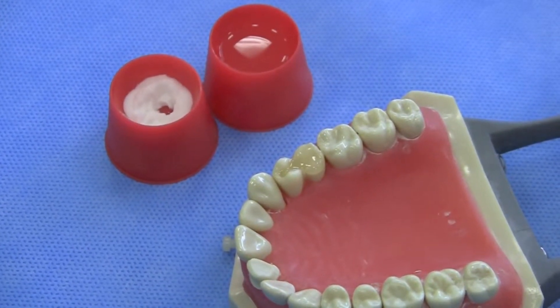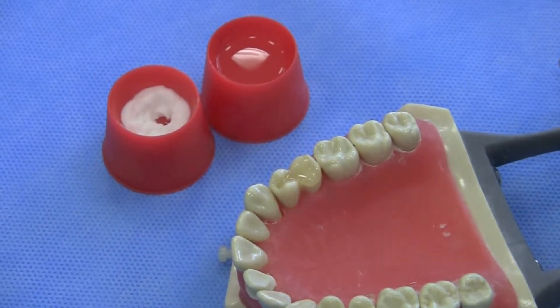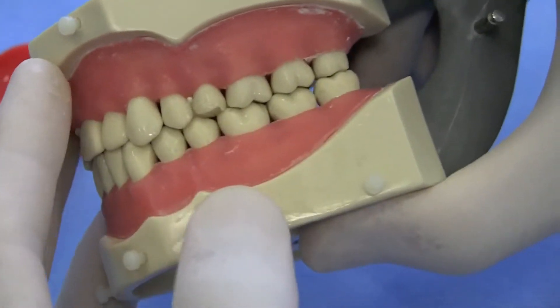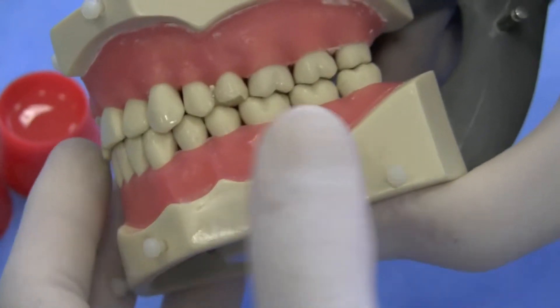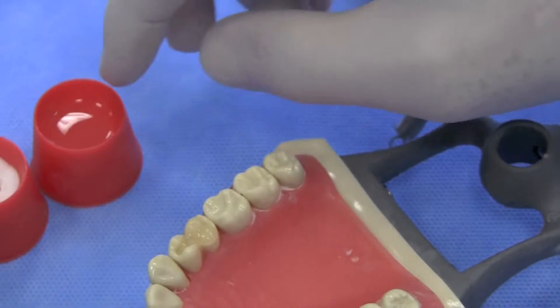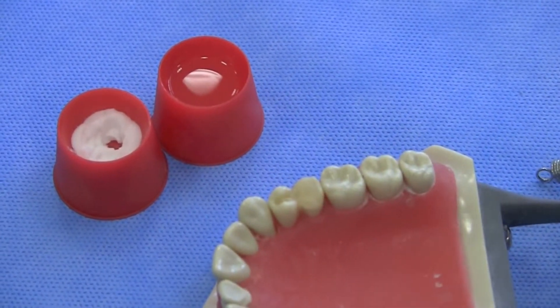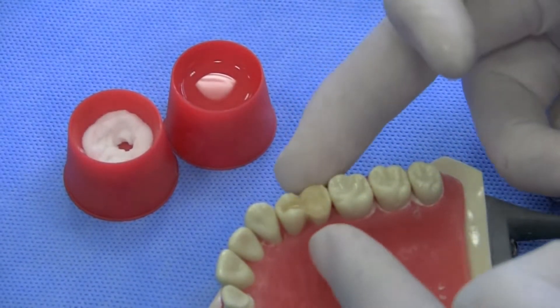At this point, take the patient's own saliva and wipe it on the opposing teeth. When the patient bites together and goes through excursive movements, the saliva prevents it from sticking to the opposing teeth. Your finger, which also has saliva on it, can be used to push and pack the material around. Have the patient bite down again and the occlusion will be optimal. Once done, instruct the patient that they will not be able to floss between their teeth.